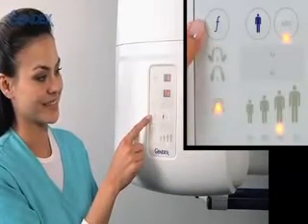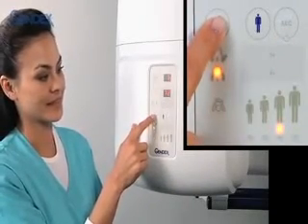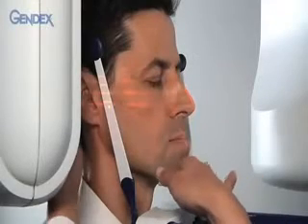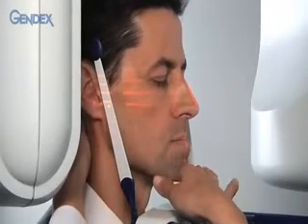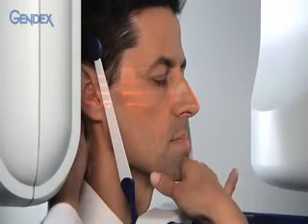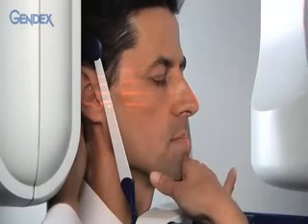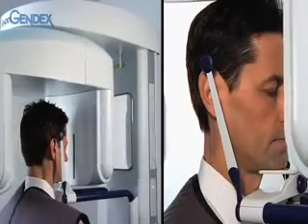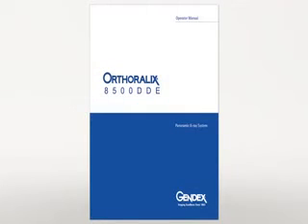For frontal TMJ exposures, push the function button to highlight the frontal TMJ choice. Ask the patient to protrude the mandible. Tilt the patient's head down to five degrees past the Frankfort plane and line up the lateral vertical line with the lower cuspid. Clear the area and trigger the exposure. For more information, please consult the manual. Thank you.